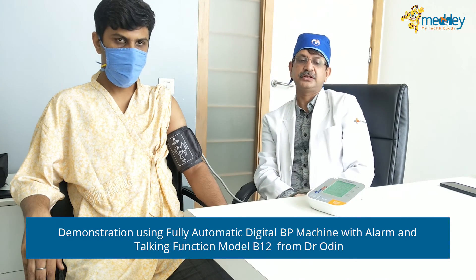As you can see, this device gives a very accurate measurement and also tells you whether the reading is normal or abnormal. If you feel the reading is not normal, you can take a second reading, but the gap between the two readings should be at least one minute, otherwise it will give you an erroneous reading.